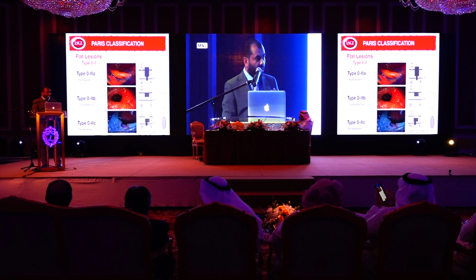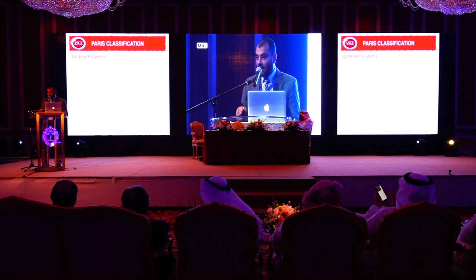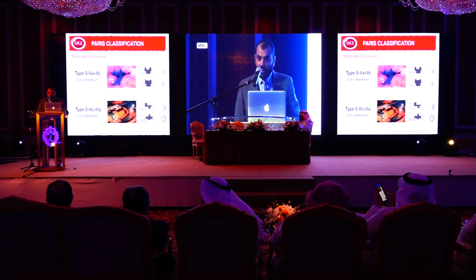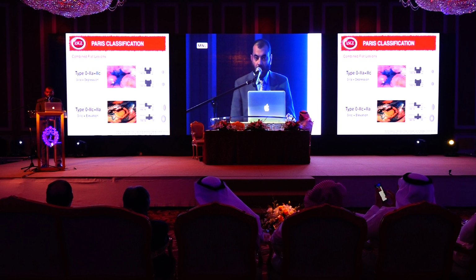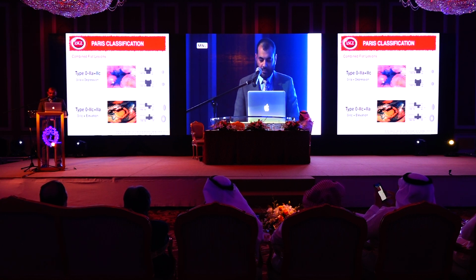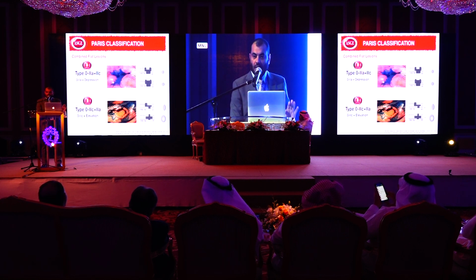Any lesion with a depressed area is alarming for invasive carcinoma and could be deep submucosal invasion. A combined lesion, type 0-IIa plus IIc, is an elevated lesion with a depressed area. The whole lesion is elevated, just with a depressed area. And type 0-IIc plus IIa is a depressed lesion with an elevated area. The whole lesion is depressed, just with a small elevated area. Both lesions are alarming for the same finding, invasive carcinoma.